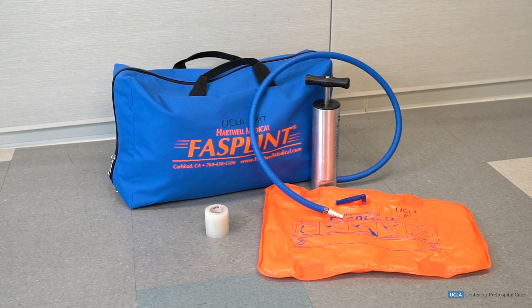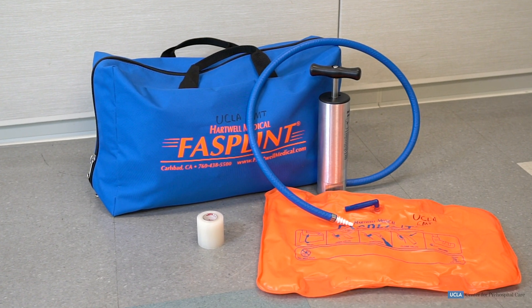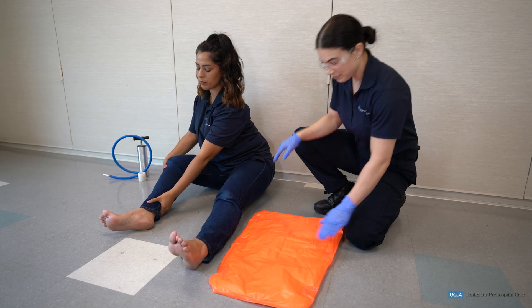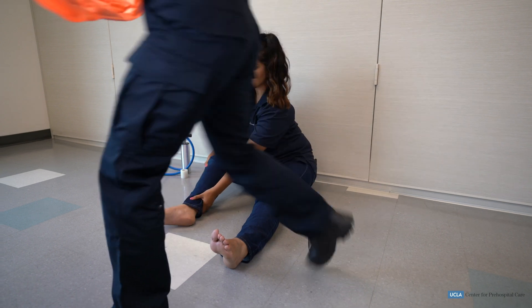The EMT will then select the proper splinting materials to immobilize the injured long bone. We will be using a vacuum splint to secure the tibia and fibula. The EMT will then measure the splint on the uninjured extremity.